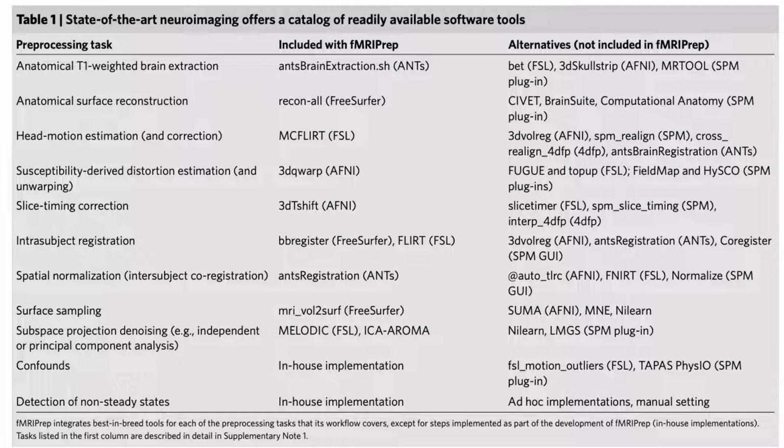So in terms of the documentation, it's quite well documented, explaining all the steps, and they're chosen by the developers, such as to not use BET, which is probably a very good thing, and to use the ANTs brain extraction. And they have slightly tweaked some of these things to work better across different datasets, such as the brain extraction. I haven't had an issue where it doesn't extract the brain correctly. And basically, it does explain all the options that are used to run the pre-processing.